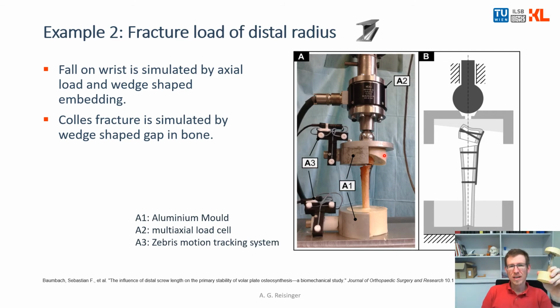Because usually when we get the donor bones for studies to our lab, these are full bones. So they're not bones where they suffered from this fracture and have, at this particular point in time, this plate as an implant. No, we get the full bone without implant. So we have to introduce the fracture and screw in the implant.